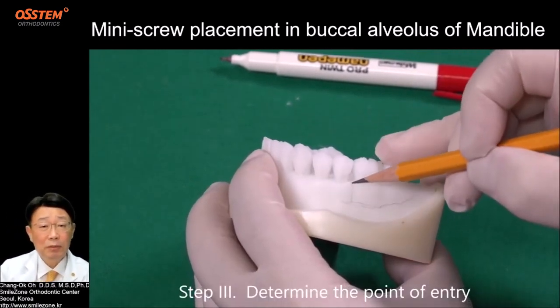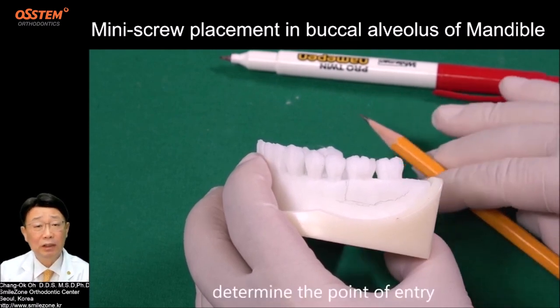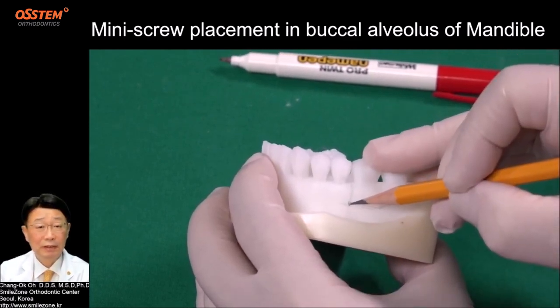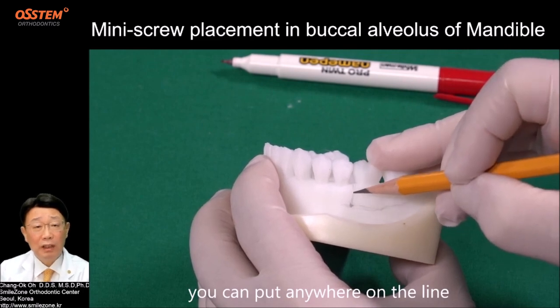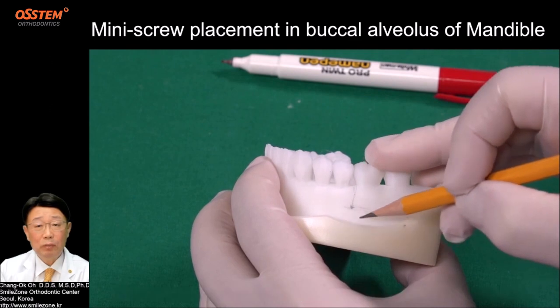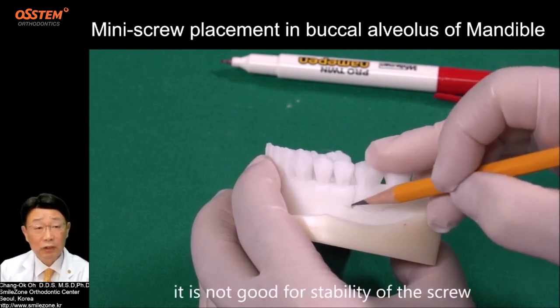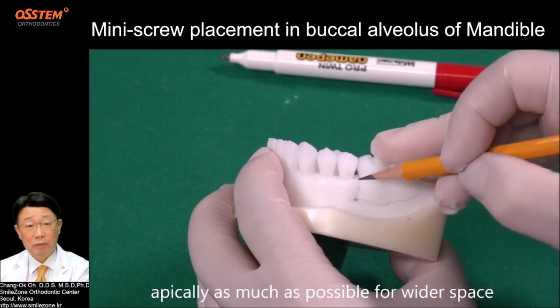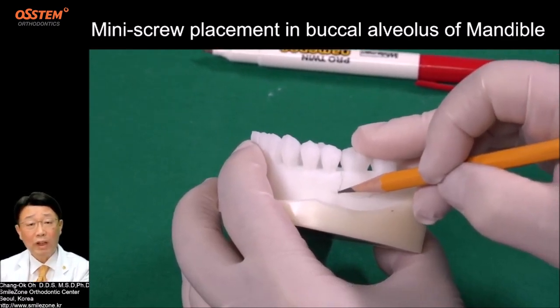Step 3: Determine the point of entry. Once the vertical line is marked, determine the point of entry. You can place it anywhere on the line, but because in the free gingiva the tissue is very movable, it is not good for stability of the screw. Choose the attached gingiva, as apically as possible for wider space.